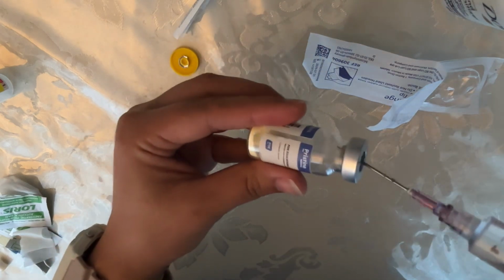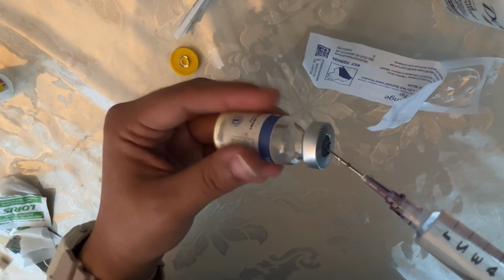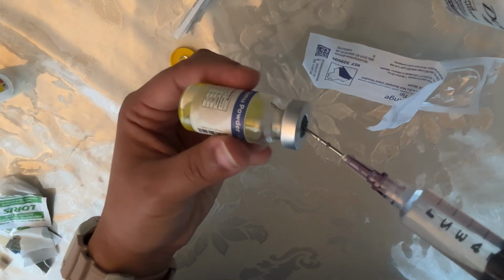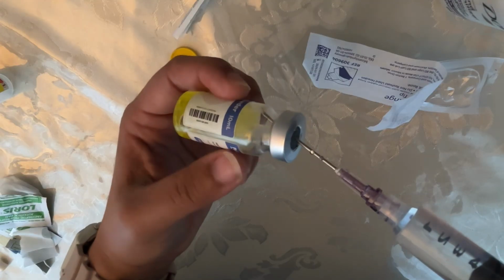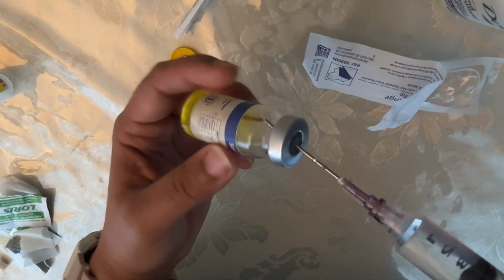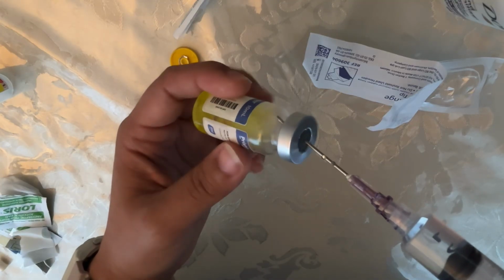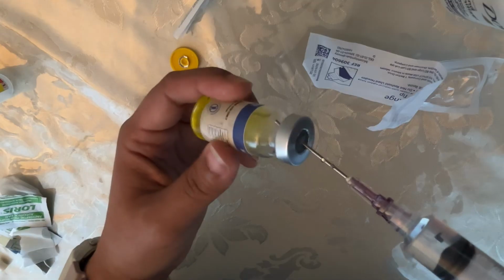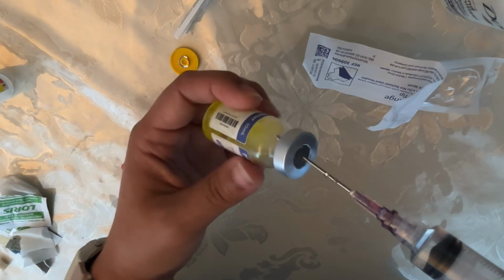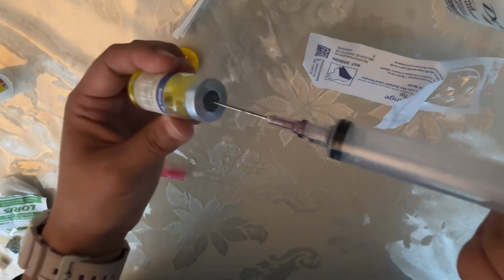I'm going to do this slowly and start on the side, and just slowly insert my sterile water to slowly reconstitute the medication inside. And all 7.7 is in.